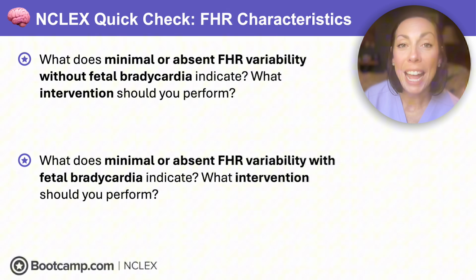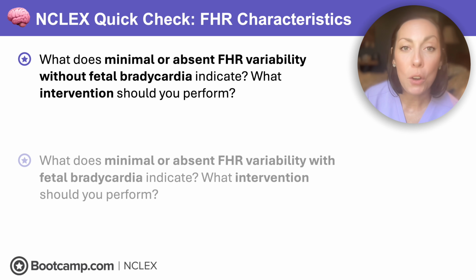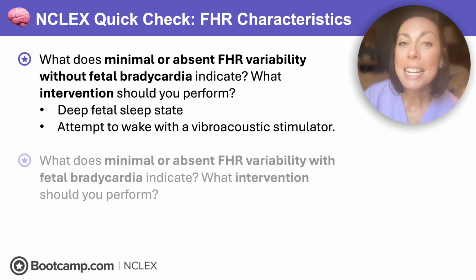All right, time for your first NCLEX quick check. So pause and try to answer. What does minimal or absent fetal heart rate variability without fetal bradycardia indicate? What interventions did you perform? Well, this indicates a deep fetal sleep state, which can be okay, but we want to attempt to wake that fetus with a vibroacoustic stimulator.